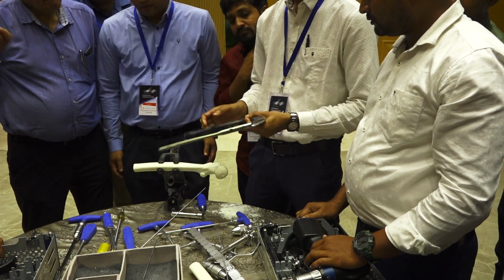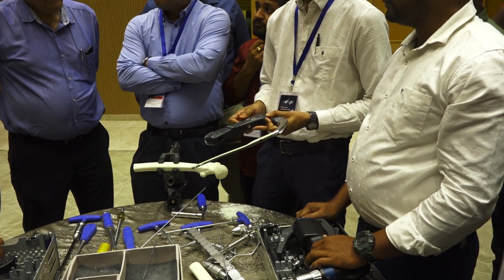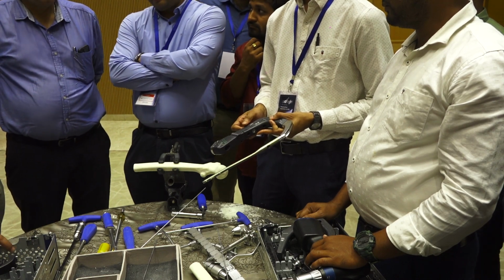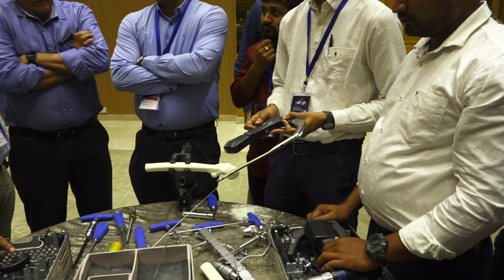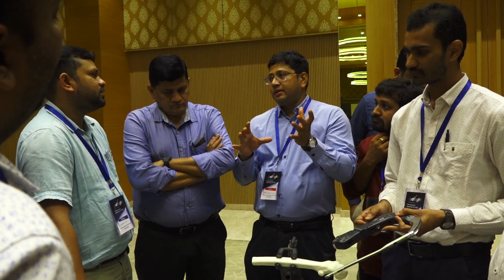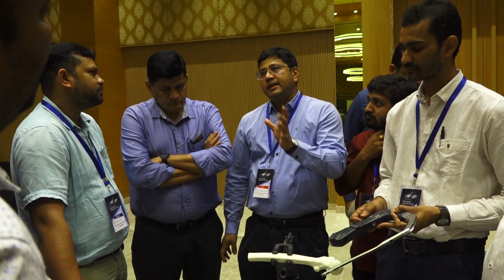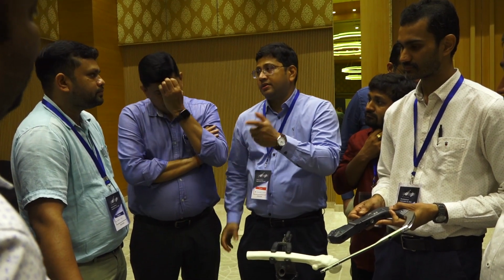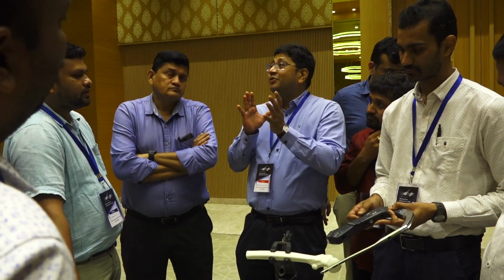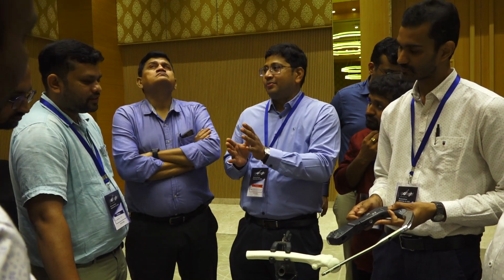If it's an unstable fracture with a posteromedial comminution, then we have to go for center. We don't have any other option. Again, the point is to maintain good anatomical alignment and put it in the center so that you can do a cement augmentation. If you are planning for a cement augmentation, go center. If you are going for the densest bone, go a little inferior and posterior.